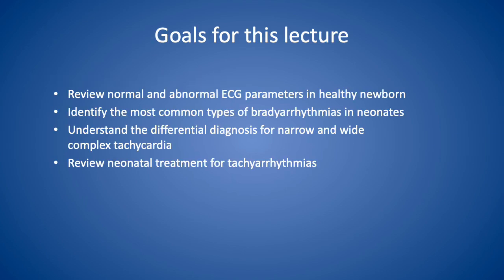The goals for this lecture are to review the normal and abnormal ECG parameters in a healthy newborn. We'll review and identify the most common types of bradyarrhythmias seen in neonates, and then understand the differential diagnosis for both narrow and wide complex tachycardia. And while we do that, we'll review options for neonatal treatments for tachyarrhythmias as well.